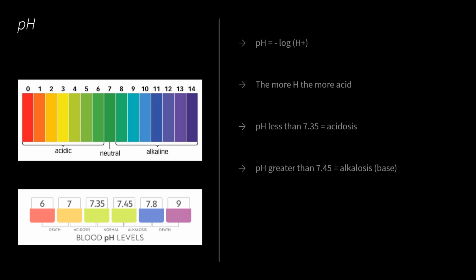So the first major thing that we're looking at when we look at an arterial blood gas is the pH. And like I said, I'll probably do another video going over just acid and base in general, because I know that's a kind of dry topic that most people skim over. And then as you get into emergency medicine, you really start to need to understand this, since acidosis is a primary problem that we encounter quite a bit in emergency medicine.